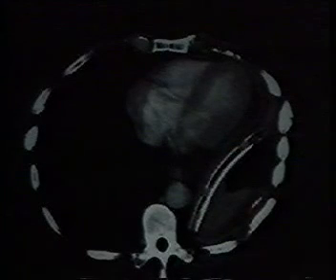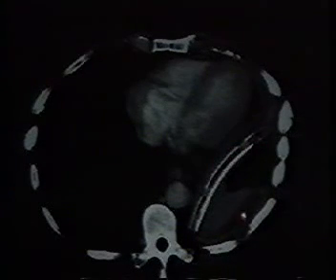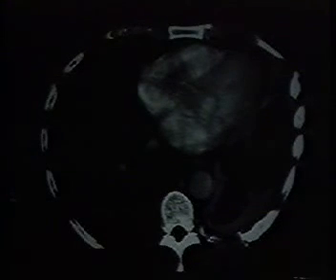Here you can see the CT image immediately after the catheter is placed, the catheter in the left lower thorax with a lot of fluid and blood adjacent to it. And here's an image obtained after the chest tube was removed about 7 or 8 days later, in which you can see there's still some residual collapse, but that we have fairly nicely evacuated most of the blood and infected fluid from the pleural space.